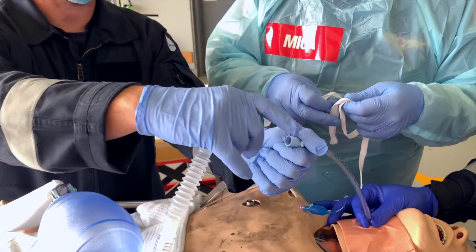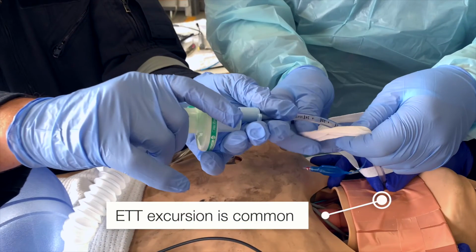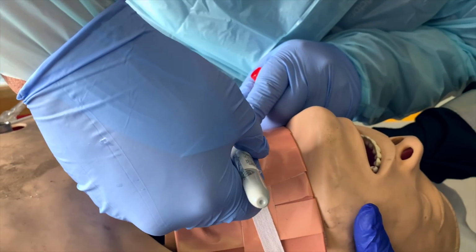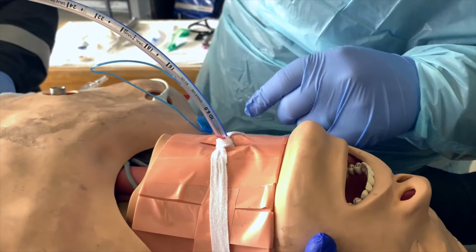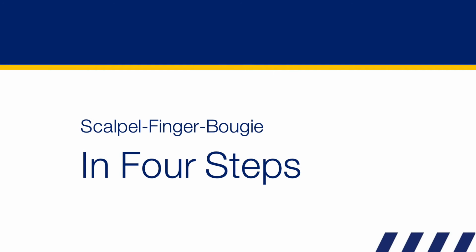Continue the ventilation strategy while gripping the ETT at the base during securing. It's not uncommon for the ETT to be accidentally pushed further down the trachea during this stage. Consider marking the ETT or placing tape at the securing point to identify the insertion length for continuing insertion depth reference. Let's summarise by reviewing the 4 steps of the procedure.